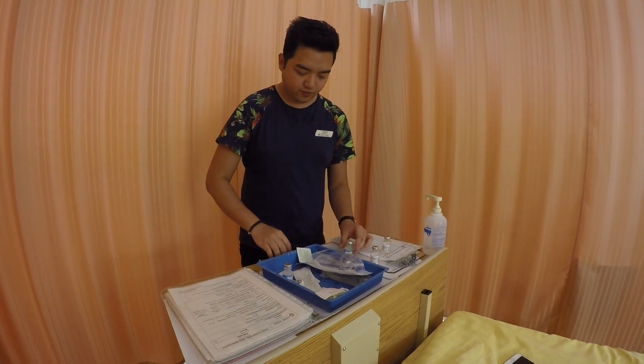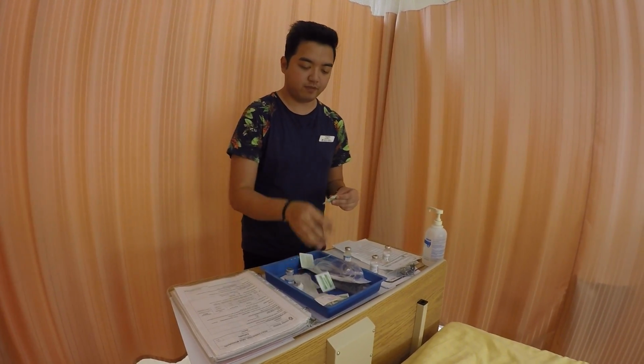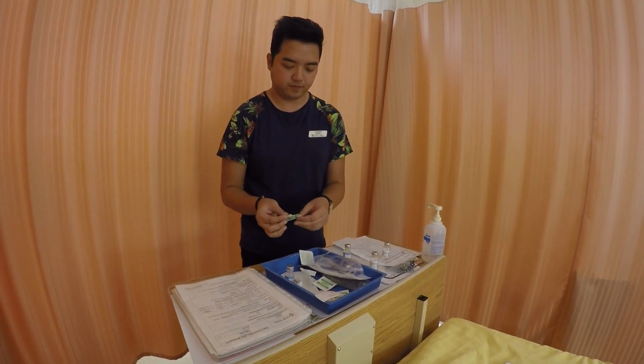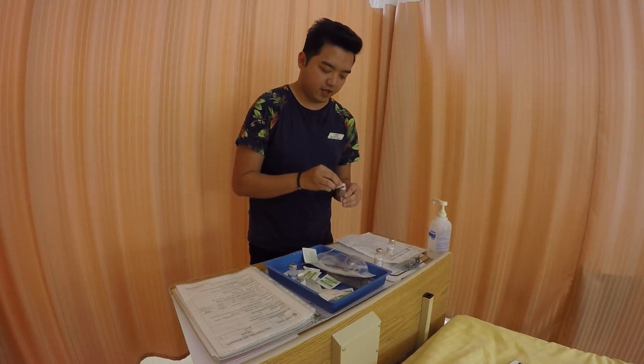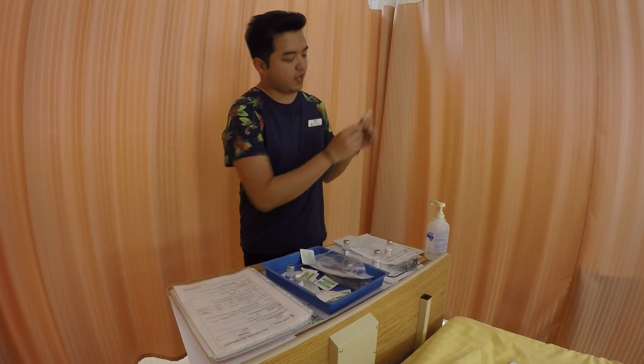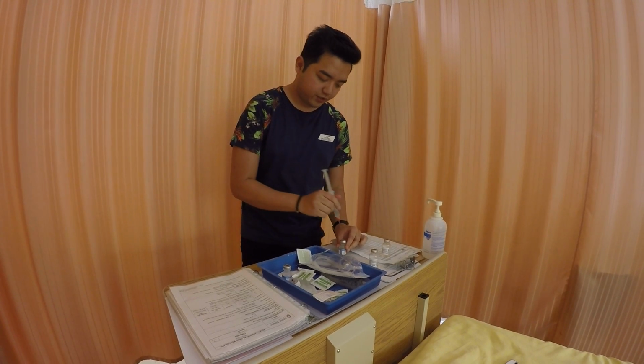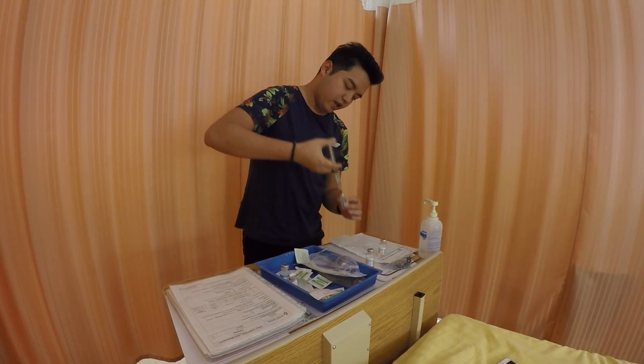Next thing to do is the other vial. Same thing as the first one we did. Clean the opening for 30 seconds, let it dry for 15. Draw 10 ml of air and inject.